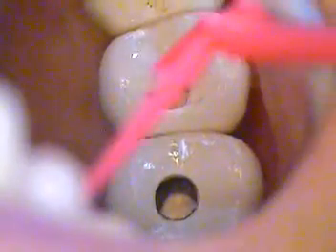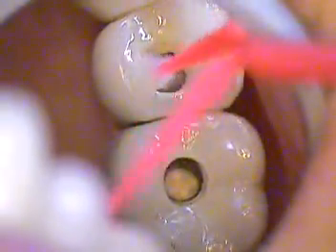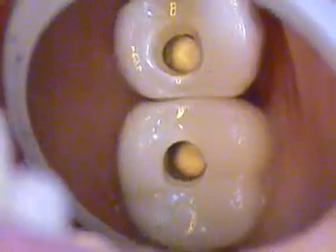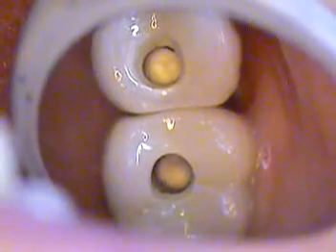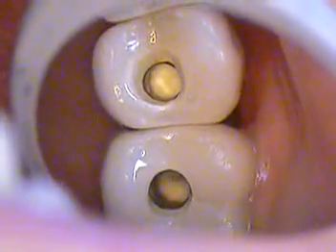It's like a dimmer switch — we go down to less than one watt of power on that light bulb. Thomas Edison was right; you don't need a lot of light to see. For the viewers, we can almost do it without light. We've got about a 30-second paint on right now, going well into the etched and silanated porcelain surface. I etch on this type of ceramic — it's Duceram porcelain. You can etch over a minute on that and still be okay. For the newer porcelains out for veneers, you're looking at probably about 20 seconds of etching.